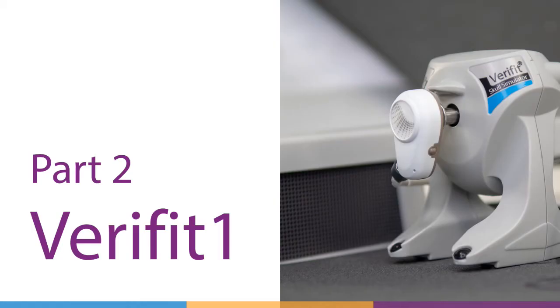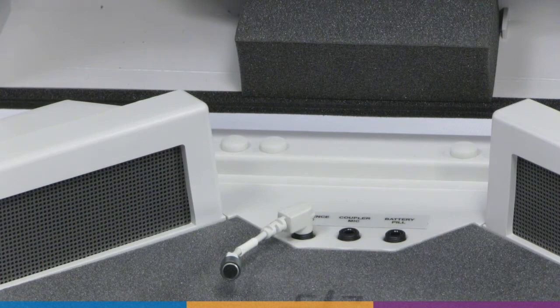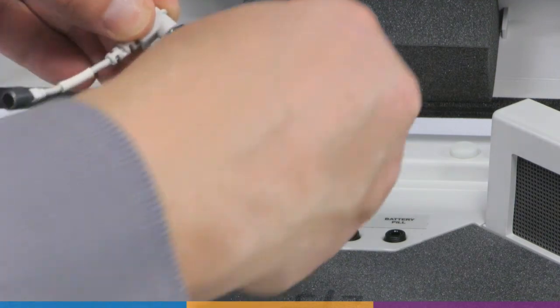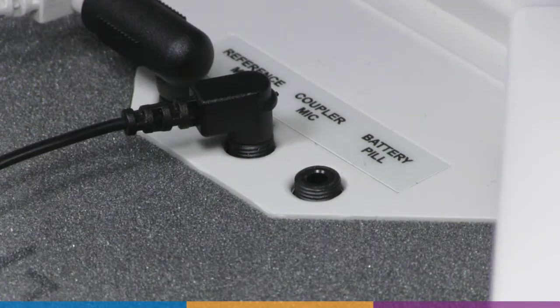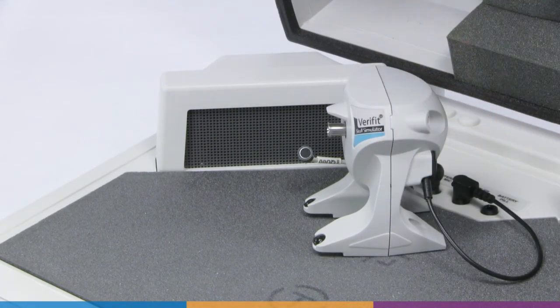Part 2: Using the Skull Simulator with the Verifit 1. Disconnect the coupler mic from the coupler jack in the Verifit 1 test box. Disconnect the reference microphone and reconnect it with the supplied black ref mic adapter. Connect the skull simulator to the coupler jack. For left devices, position the skull simulator in the test chamber so that the artificial abutment is perpendicular to the main speaker on the left, with the blue label facing you. The black extension will allow the reference microphone to run between the skull simulator and the speaker to reach the device.